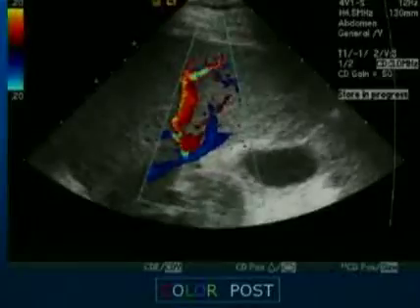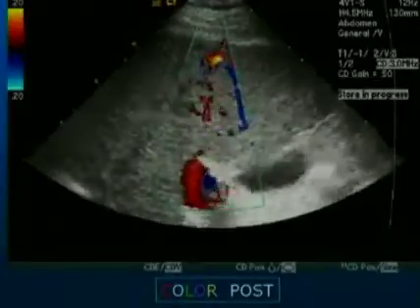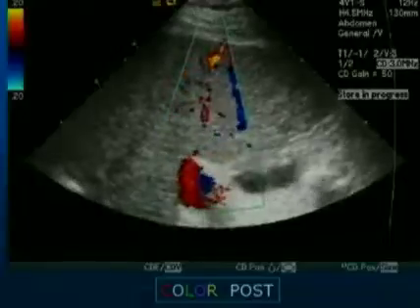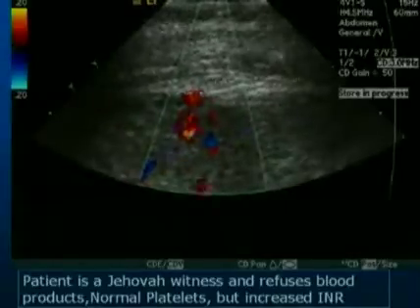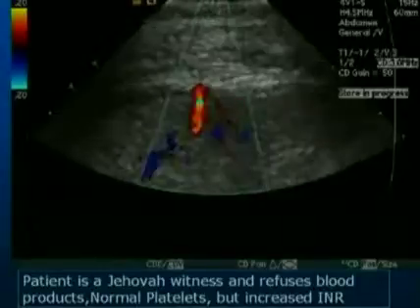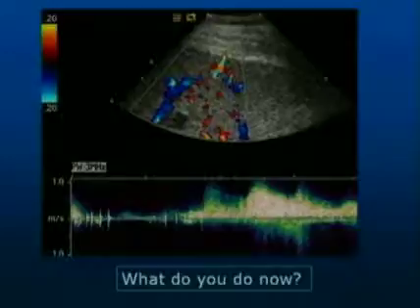As I pull back all the way, I will stop and cauterize that tract. But what I find with color flow post, and you have to look very carefully, at the capsule there's a very small area of increased color flow. As I mag that image, you can see the color flow here as a very small bleeder that occurred and went subcapsular. Unfortunately, when I did Doppler through this, it was basically an arterial bleeder.